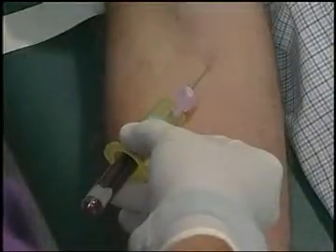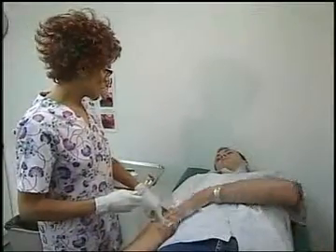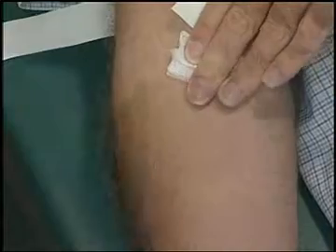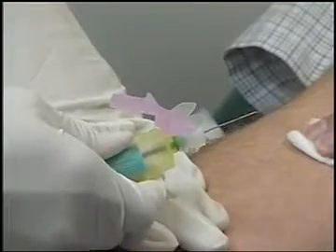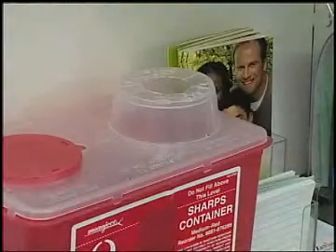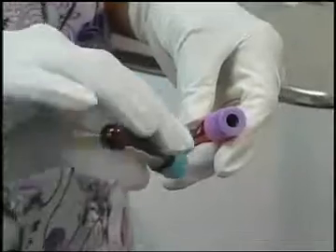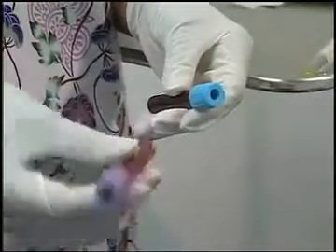Once you've inserted your last tube, immediately release the tourniquet, remove the tube from the rubber sheath, and then remove the needle while covering the site with a gauze square. Okay, Mike, you're going to need to apply pressure here just for a few minutes. While Mike is holding the gauze, attach the safety cover and discard the needle in the sharps container. Then gently rock all the tubes 8 to 10 times in a figure-of-8 pattern. This is to mix the samples.